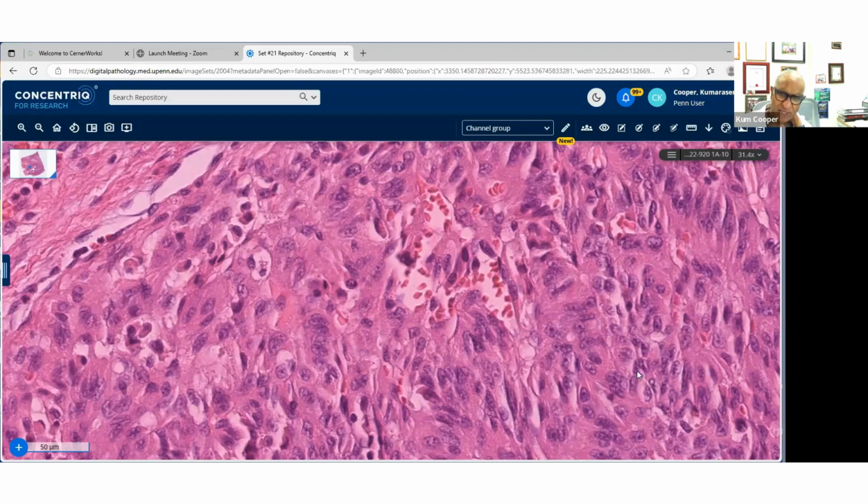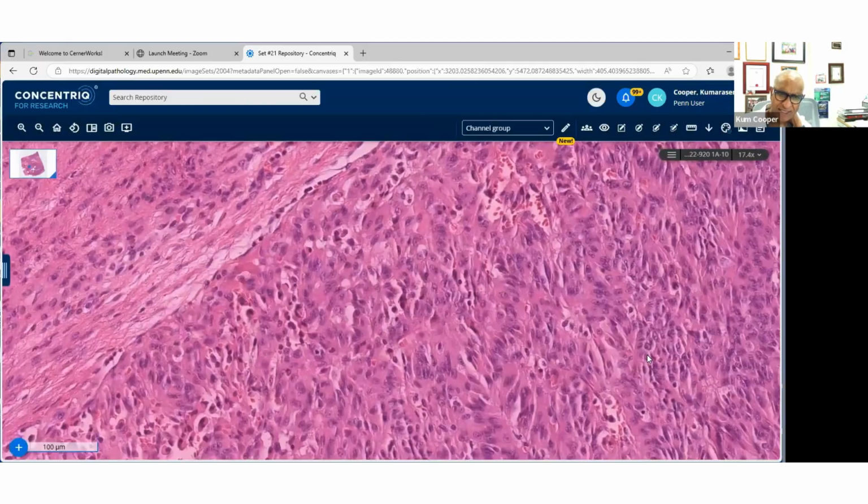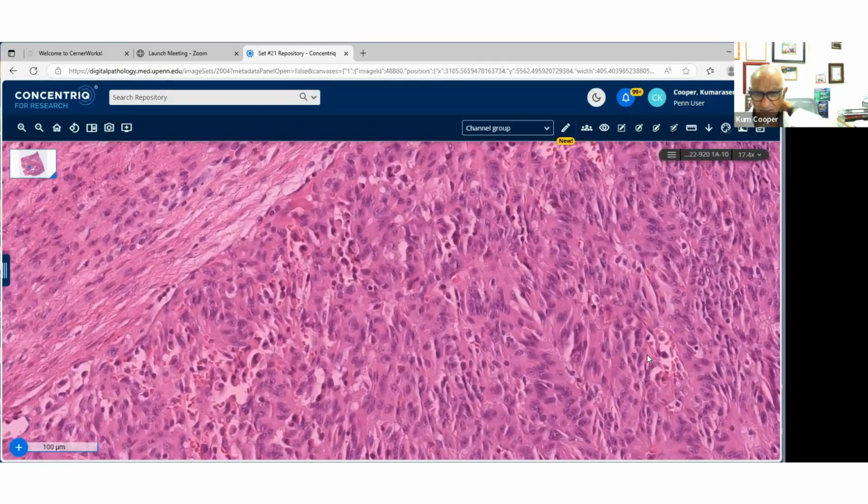The next thing you do when you make a diagnosis of PEComa is then stratify it. Is it benign, of uncertain biological behavior, or is it malignant? And there's some nice papers out there. You can look for the risk stratification of PEComas. Initially, they used to use the Folpe criteria.